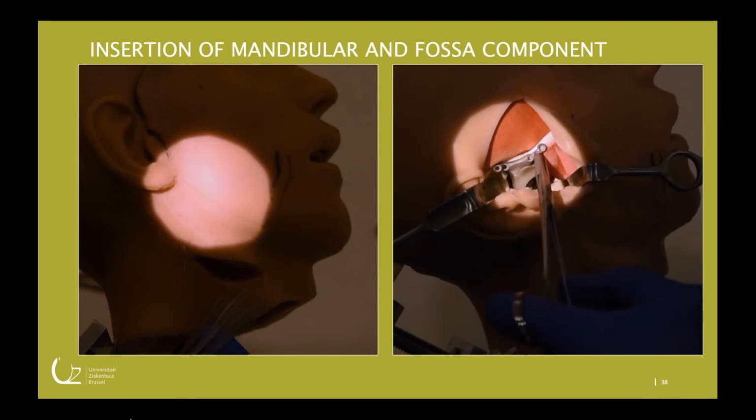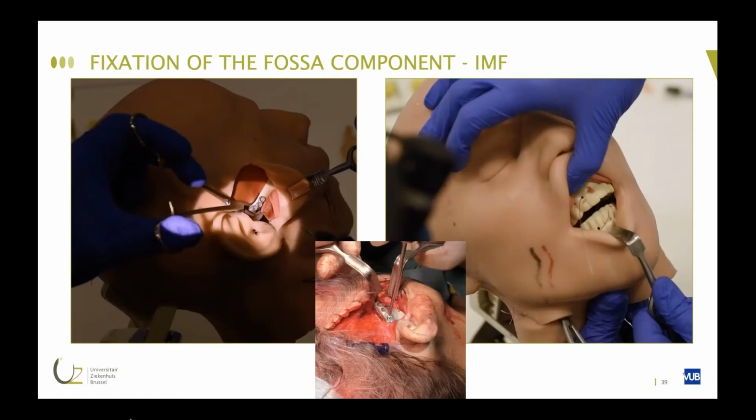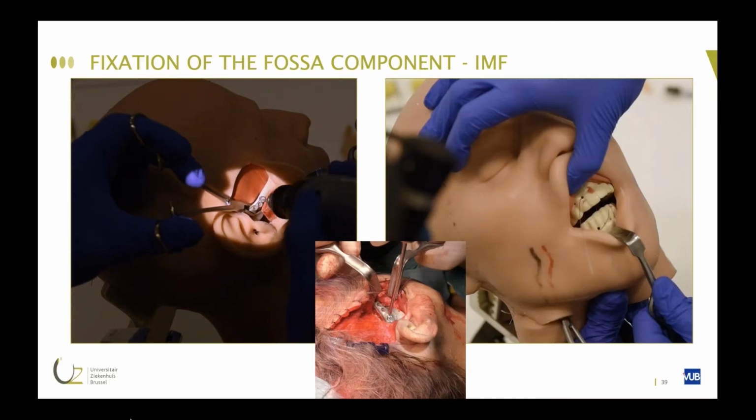Remember, the mandibular component is not fixed, is in position but a little bit lower, which facilitates the insertion of the fossa component. Also, this one is screw fixed.